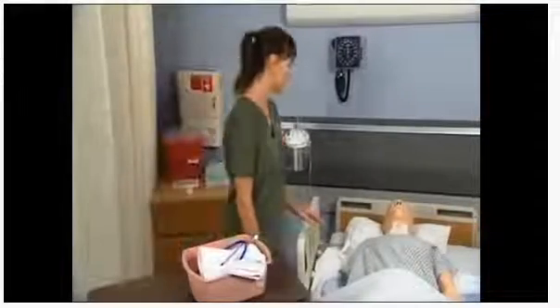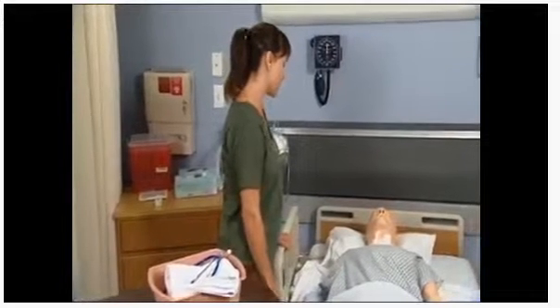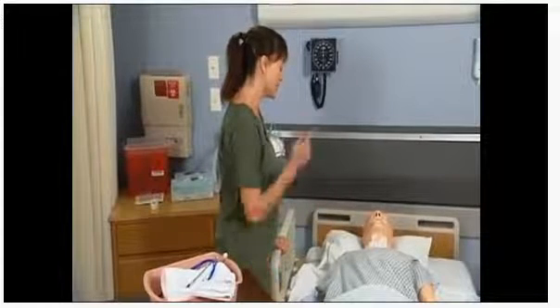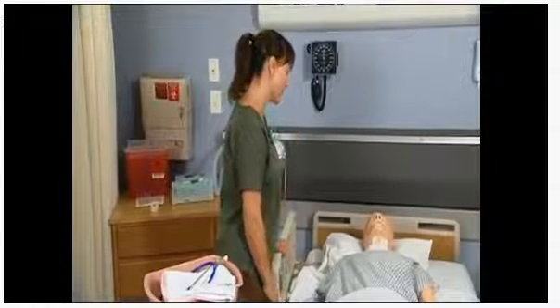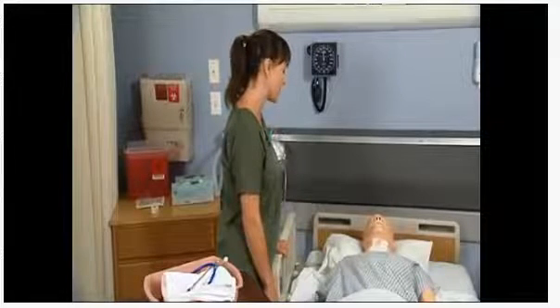Good morning, Ms. Jones. My name is Stacy, and I'm going to be taking care of you today. I have a doctor's order that we need to place a nasogastric tube. Do you know what a nasogastric tube is? Let me explain that to you. It's a tube that's going to go in through your nose all the way down into your stomach. You've come in with what's called a small bowel obstruction, and this is going to hopefully relieve a lot of the nausea and vomiting that you're having, as well as to resolve that small bowel obstruction.